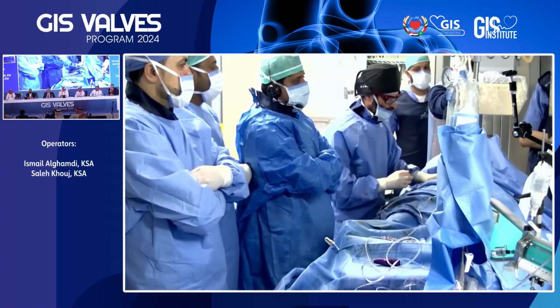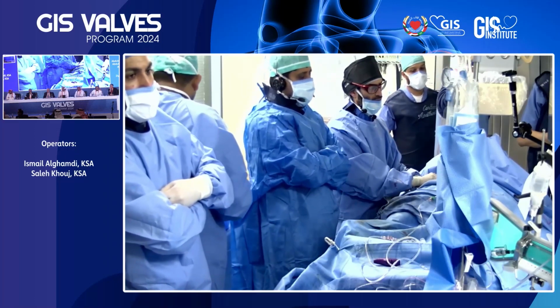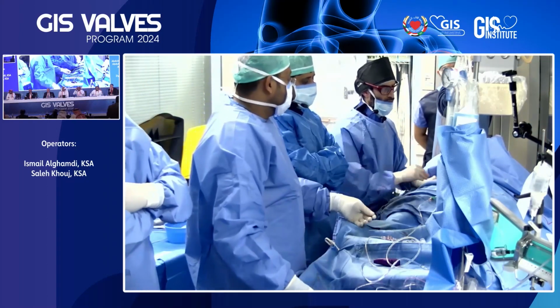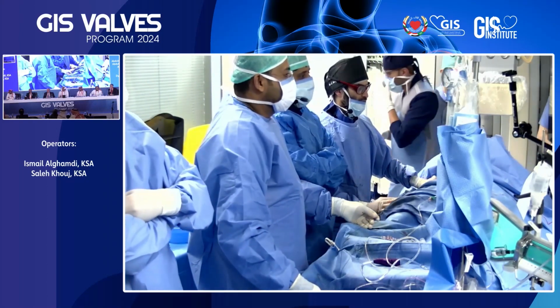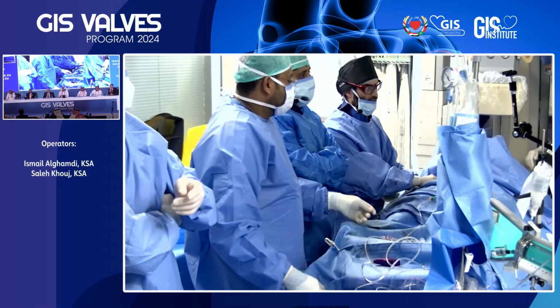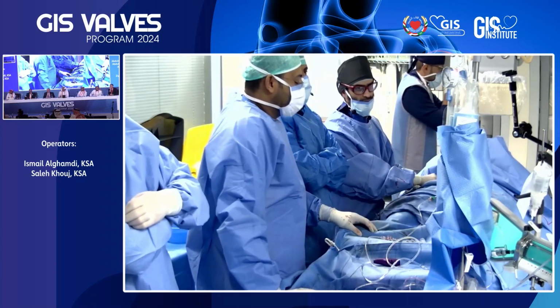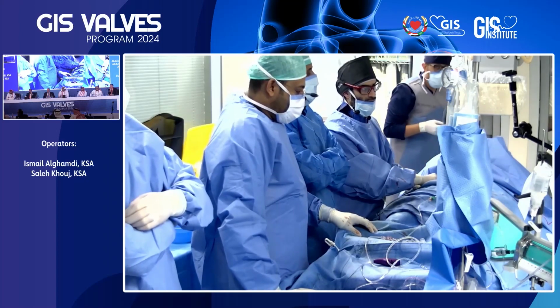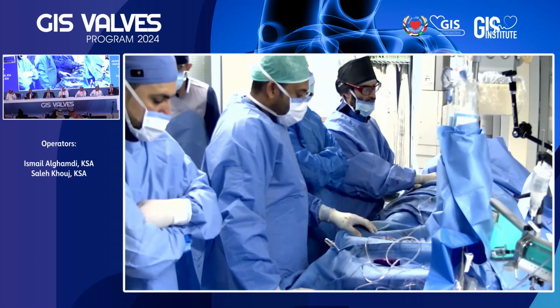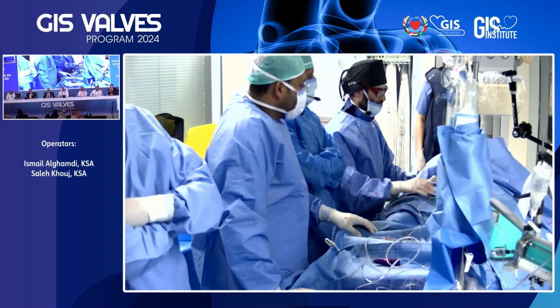Number one, what I have done probably a little bit differently. The sizing is an everlasting question. I think the 34 is out of the discussion, as far as I'm concerned, way too big. Even the 29 could be debated. If you have a 20 millimeter balloon, once you have the balloon there, why not inject? If you see that a 20 millimeter balloon is sealing, then you know you can even go further down. I don't want to discuss the intercommissural distance versus the annulus, but you could see the annulus is not the structure that is determining the size of the valve.